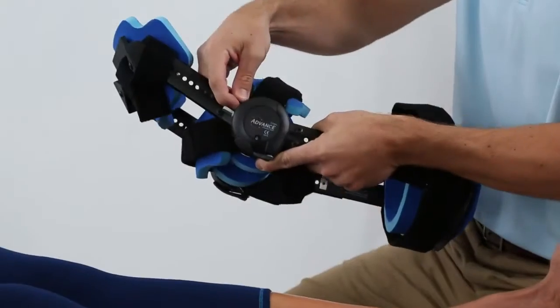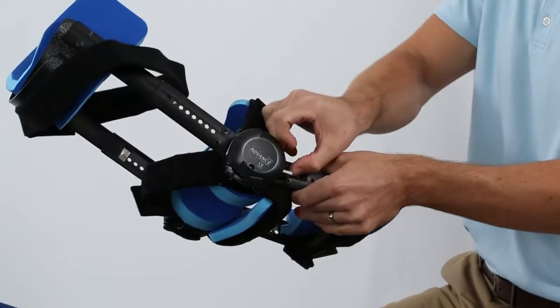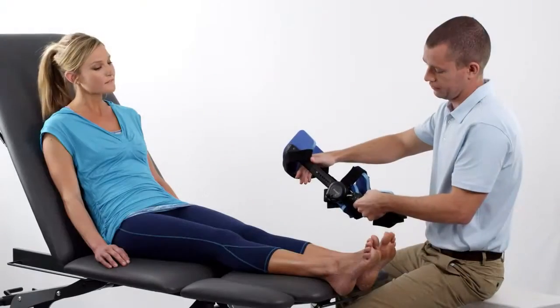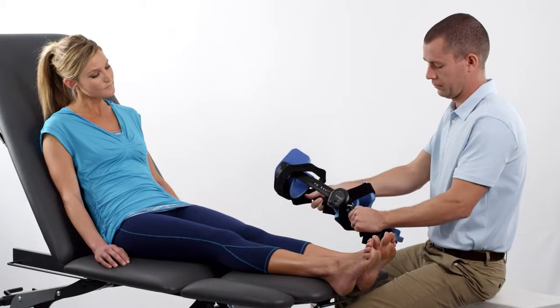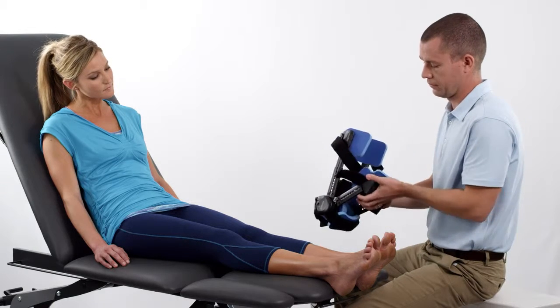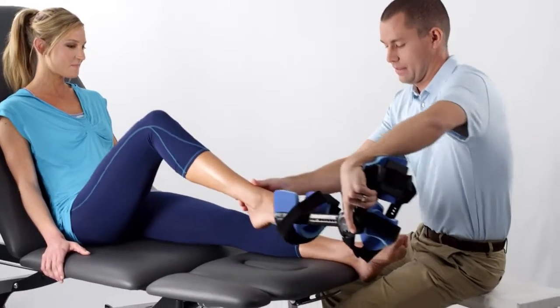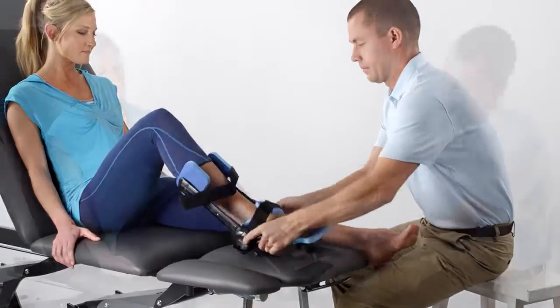To disengage the lock levers and safeties on both tension springs, release the safety and rotate it away from the lock lever. Then apply some force on the footplate strut to disengage the lock lever. With the lock levers disengaged, you may apply the orthosis to the patient's ankle.